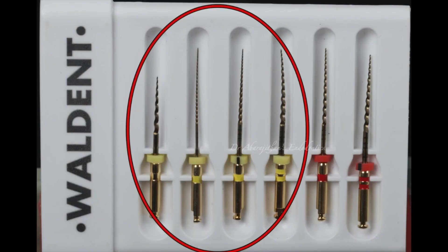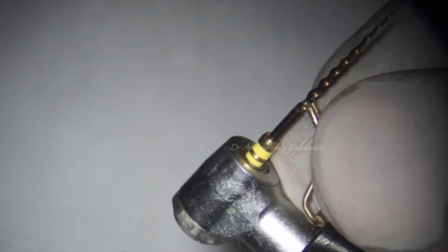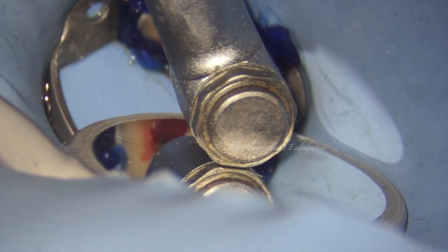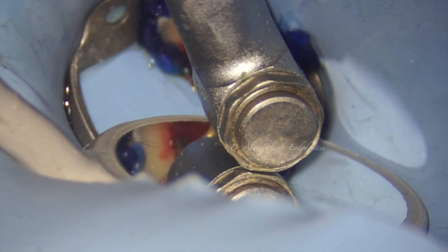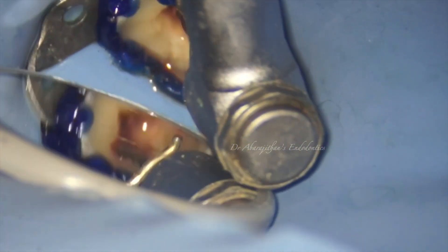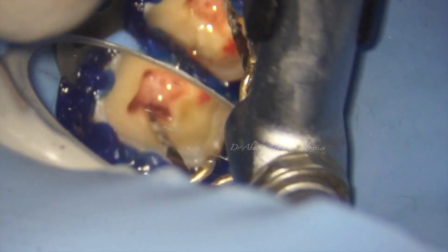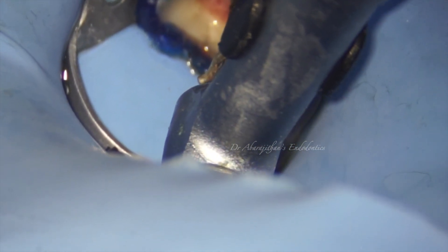There is a slight difference in the endomotor used in this particular case — this is an endomotor with a built-in apex locator, featuring an integrated endomotor and apex locator mode. The working length can be established even during rotary instrumentation. This feature makes it easy to do this technique where no hand files are used and no working length radiographs are taken, yet we still have pretty good length control during rotary instrumentation as the apex locator works continuously.